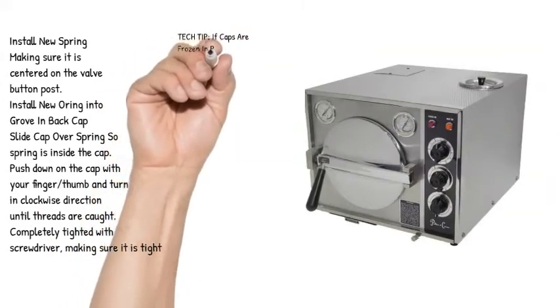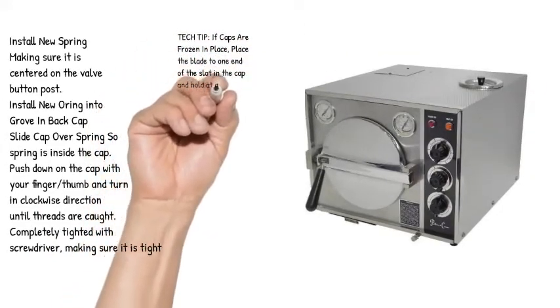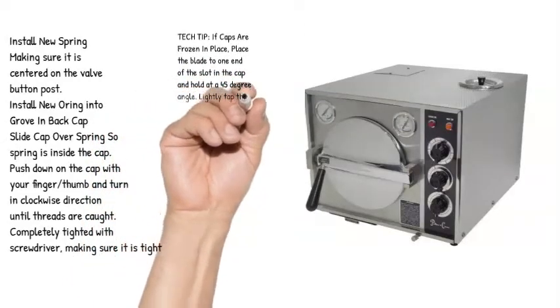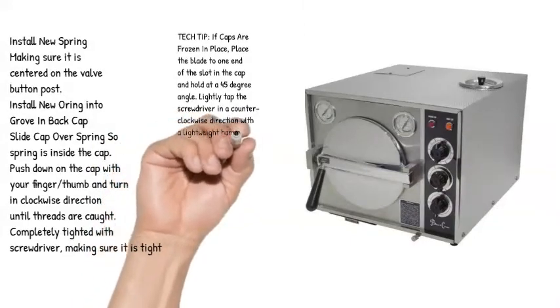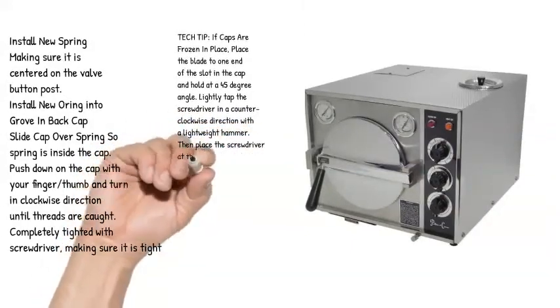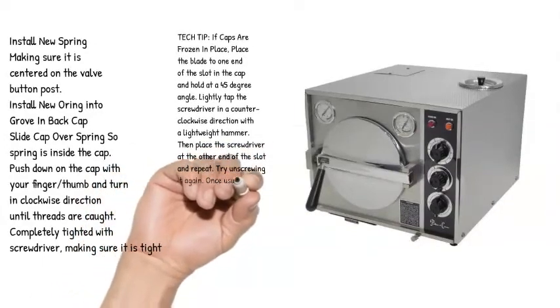Tech Tip: if caps are frozen in place, place the blade to one end of the slot in the cap and hold at a 45 degree angle. Lightly tap the screwdriver in a counterclockwise direction with a lightweight hammer. Then place the screwdriver at the other end of the slot and repeat. Try unscrewing it again. Once usually does it, but if it is still difficult just repeat as above.